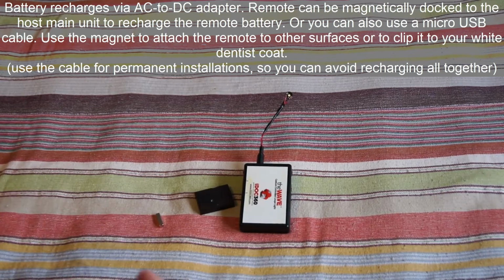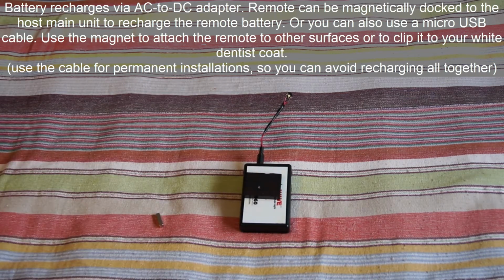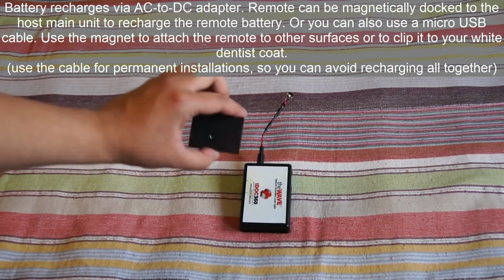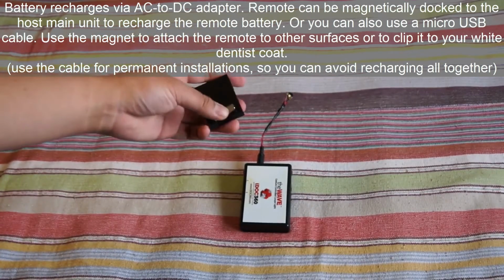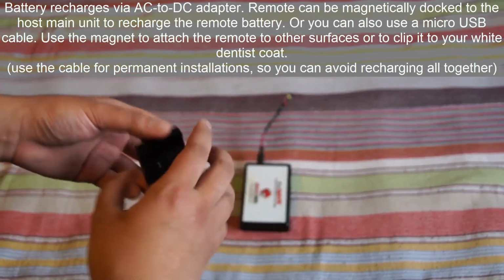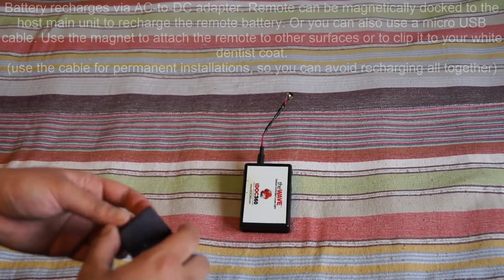But I don't like that because cables are a little inconvenient. I'd rather just plop it on magnetically, like that. Since it's magnetic, you might want to put this on a surface, and voila, there's a magnet. You can stick it wherever you want. Or you can clip it to your clothes if you want to wear it on your chest and then just use it while wearing it on your clothes.